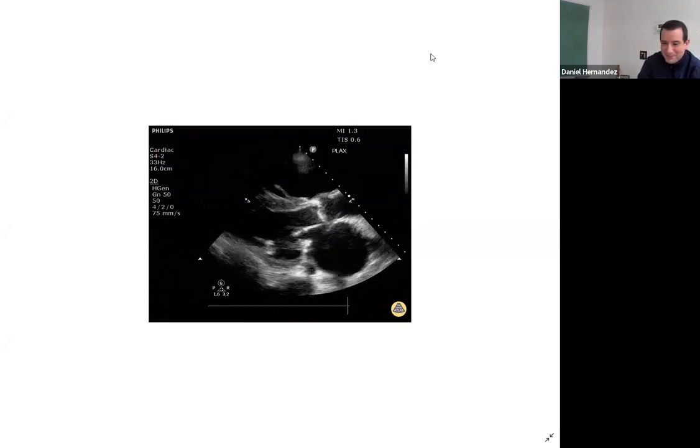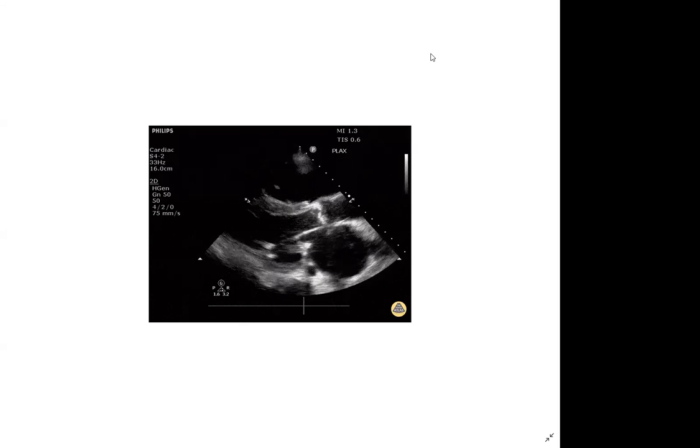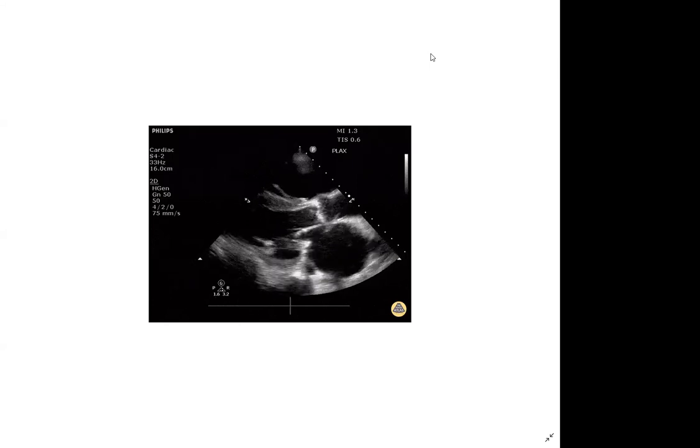This one's got a bunch going on. All right, Rachel, I'll let you go first. What do you see? What's something you see? The mitral valve, for sure. Yep. What about it? It's not opening properly. That means mitral stenosis. Good.